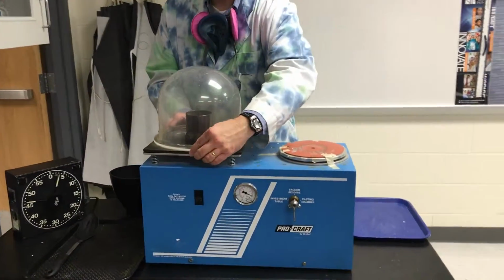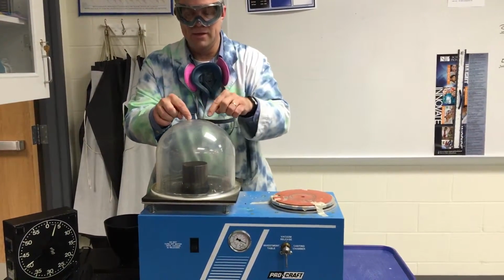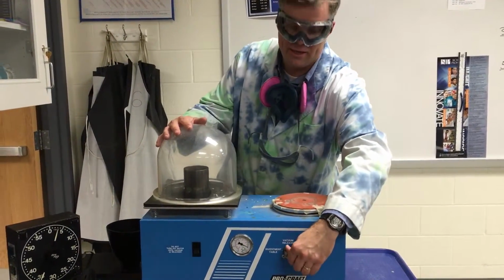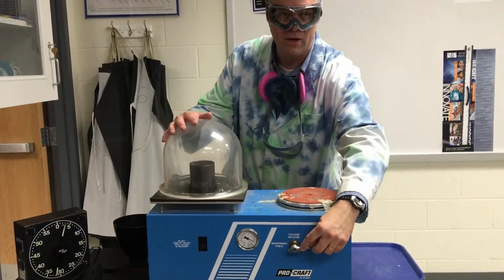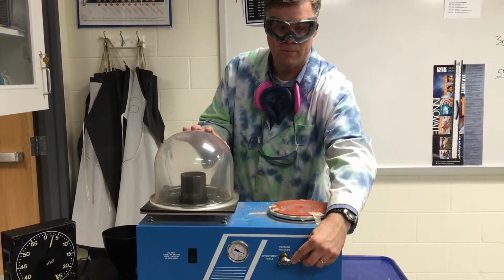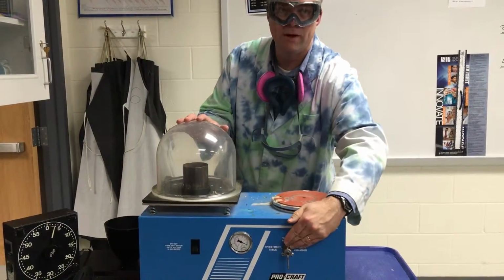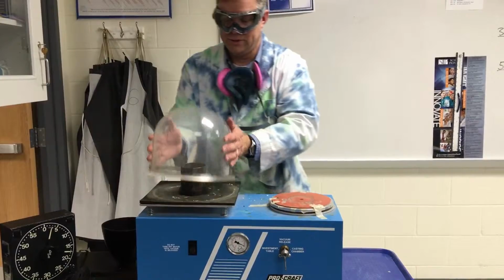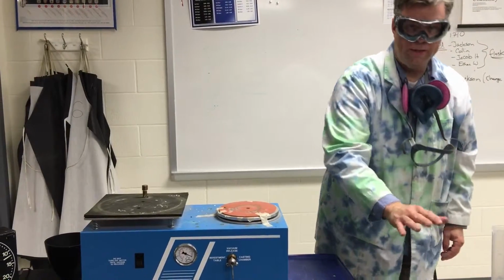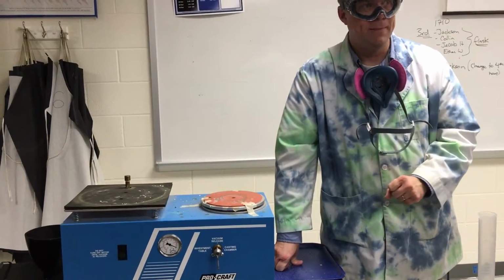This time though, you have a goal of about 60 seconds, but you don't go the whole distance unless the investment is not overflowing. So when you start it again, we power on, we engage the table. Someone should have their hand right here, ready to turn it off real quickly if it starts to bubble over. As soon as it goes for the 60 seconds, we say, okay, stop. Once we stop, we disengage, wait for it to come down in pressure, and power off. Once this comes off, you gently put this off to the side, and we are ready to wait. Again, it's going to have to wait closer to about 10 minutes or so before you can put your initials there in the top. Okay?